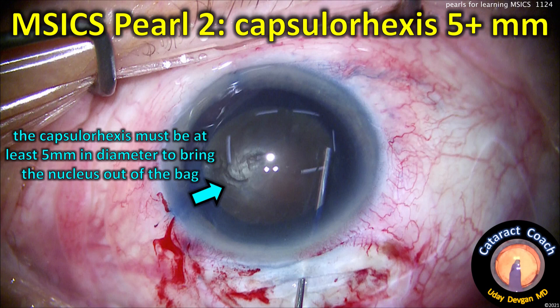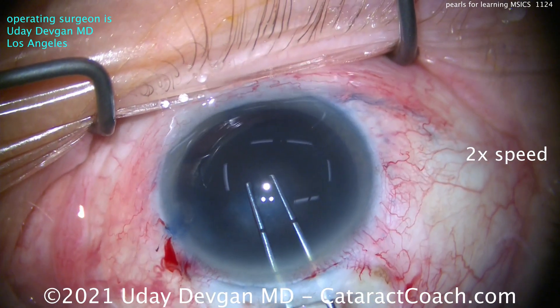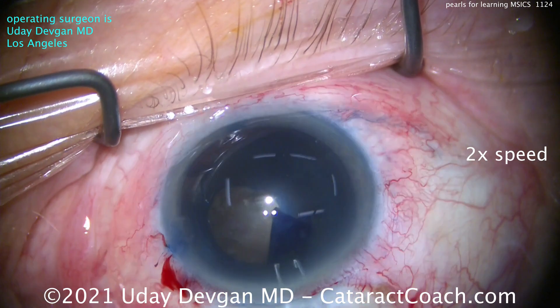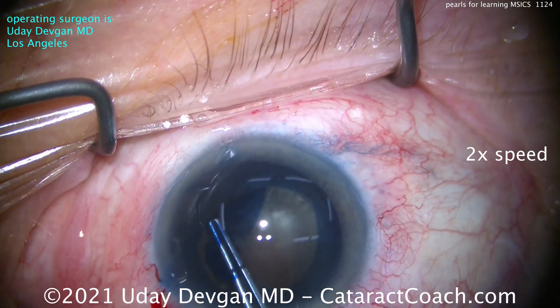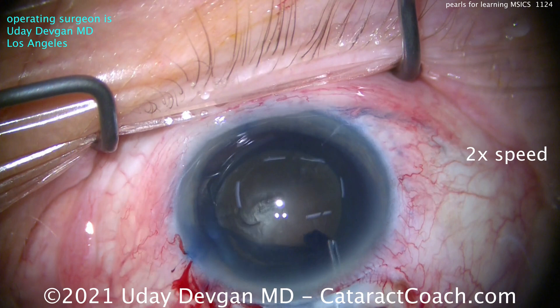The next pearl: you've got to make the capsulorrhexis large — at least five millimeters — because we need to bring the whole nucleus out of the capsular bag. I'm using forceps with marks so I can measure five millimeters, aiming for about five to five and a half millimeters. You can see that's coming along nicely.